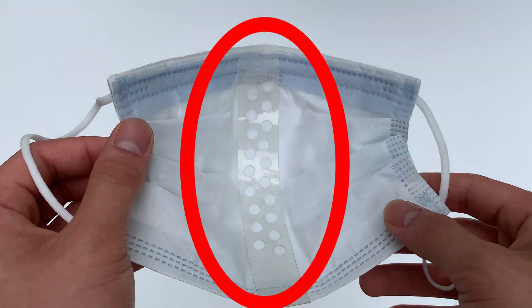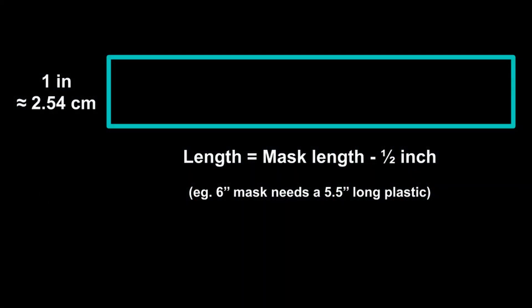The plastic will go across the mask, starting below the nose wire. Therefore, the plastic is one inch wide and slightly shorter than the mask length. If the plastic sticks out of the mask when you tape it, you can cut it shorter.